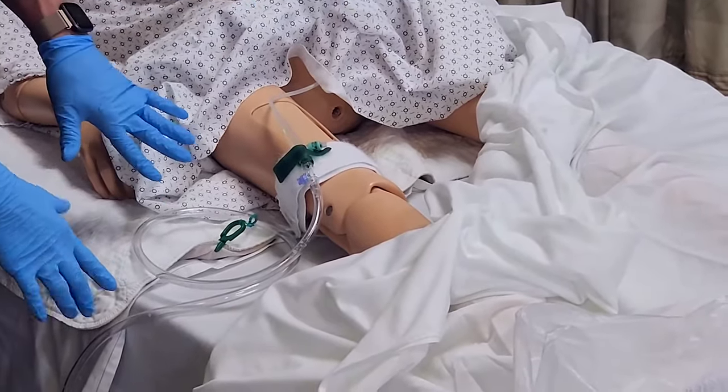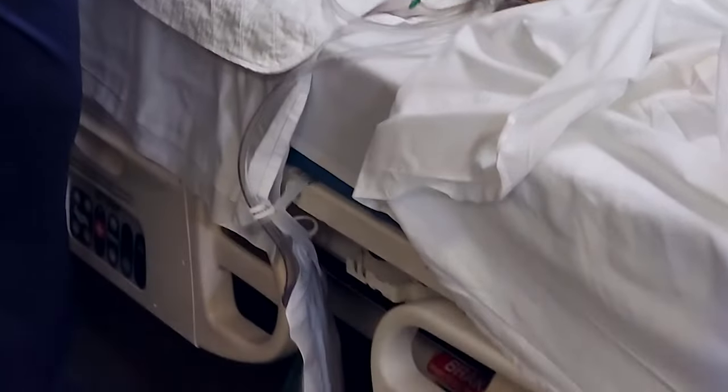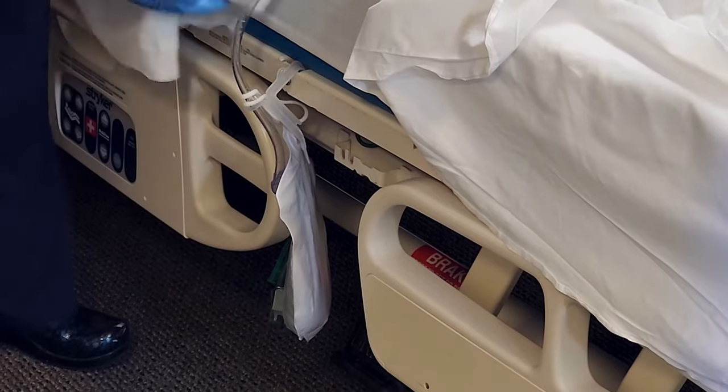So we want to follow the tubing from the resident and make sure it's going top-down, coiled if there's excess. The catheter bag hangs on the side of the bed and we need to make sure that it does not touch the floor.